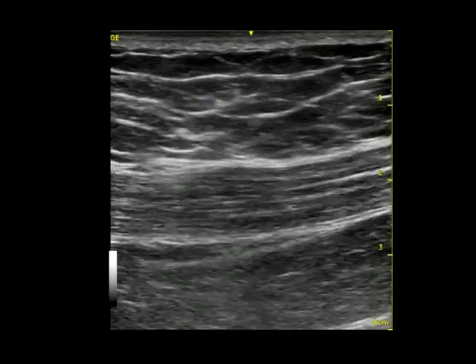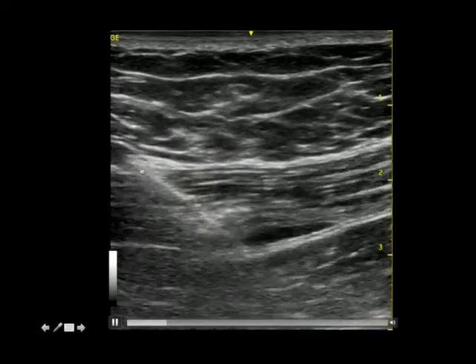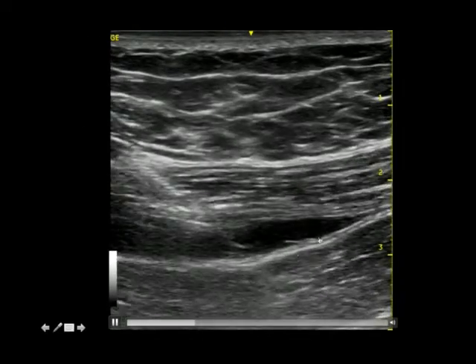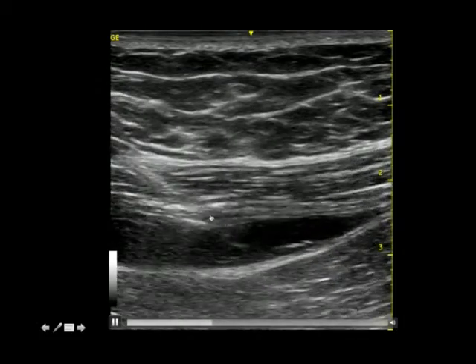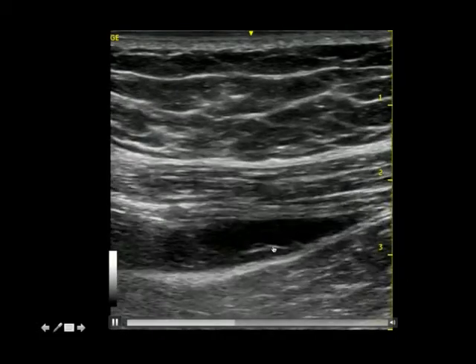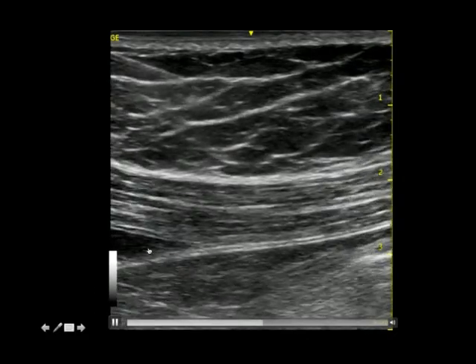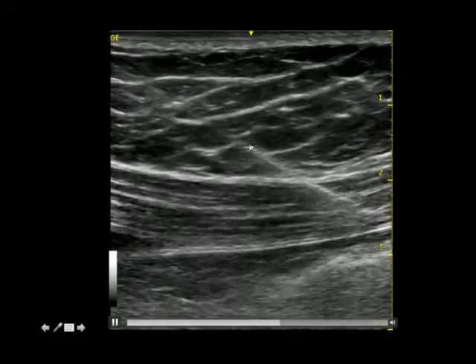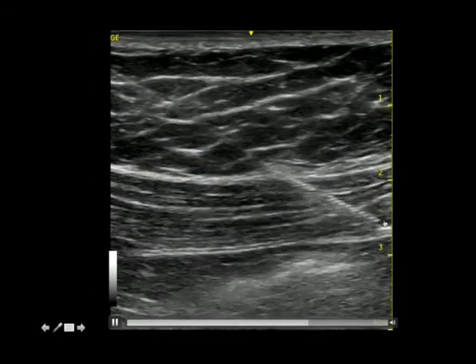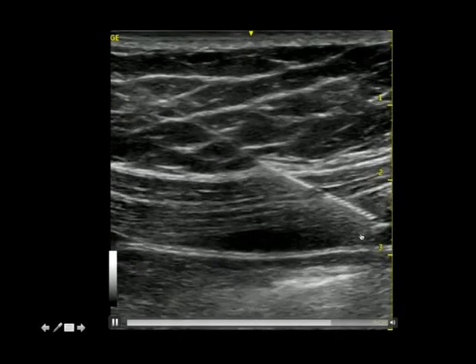This is showing the block done for the right side, with the needle coming from medial to lateral. This is local anesthetic being deposited over the posterior rectus sheath — that's the rectus muscle. In this case we're using 0.375% levobupivacaine: 10mls are deposited there, then we come out from the same entry point, go a longer distance laterally until we reach the TAP plane, and deposit local anesthetic there.